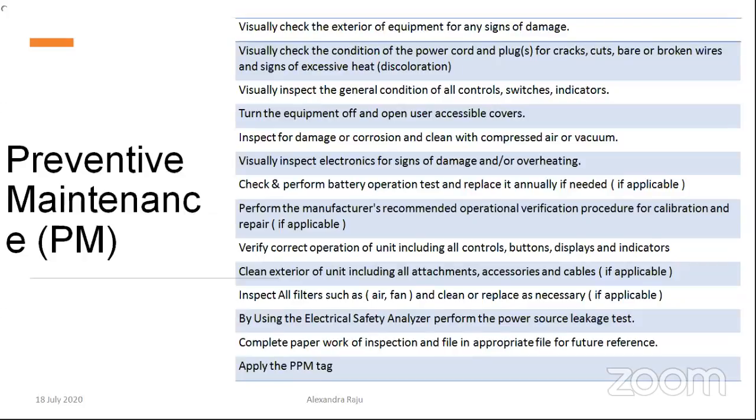So we can check in such equipment if there are any air filters, and we have to clean them. We can use an electrical safety analyzer to perform the leakage test, enclosure test, and applied parts test. You can ensure the safety of the equipment.